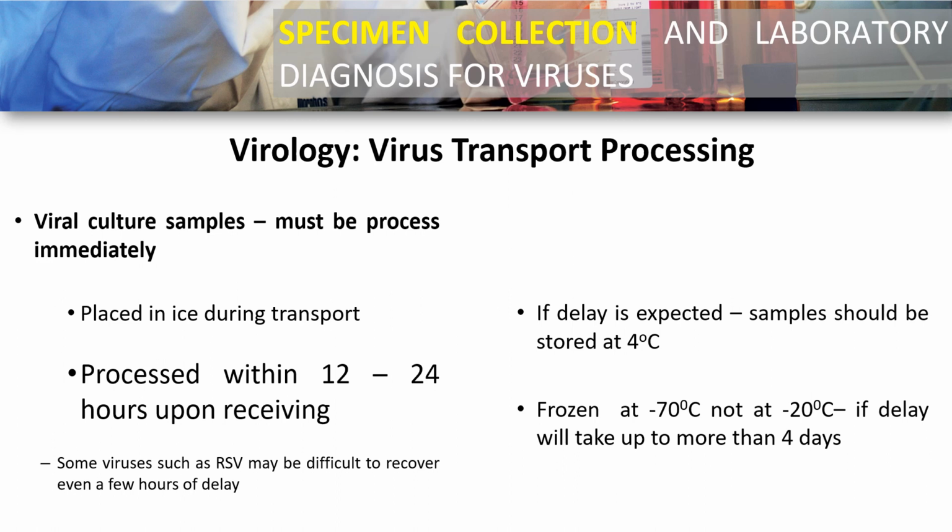Okay, let's move on to the viral culture samples. They must be processed immediately. As medical technologists or virologists, when you receive a sample, as much as possible it should be processed immediately. Pero merong mga cases, class, na hindi talaga natin mapaprocess, diba? So, ano yung mga kailangan natin i-consider?